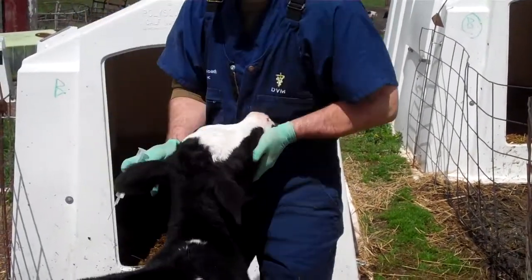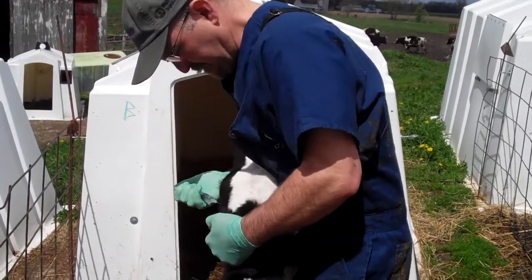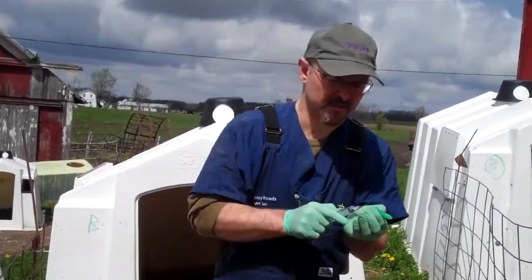Administer that local anesthesia in there and rub it in. It burns just a little bit while it's going in. Rub it in and wait for his horns to be numb.